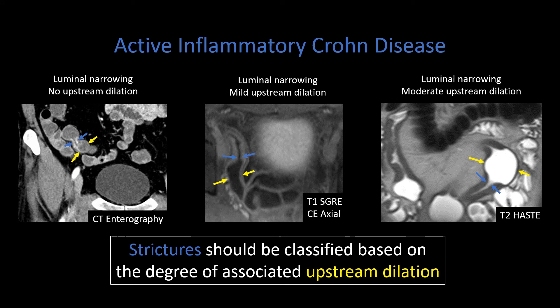Here are examples of active inflammatory Crohn's disease with stricture. On CT, you can see a very short segment stricture characterized by two blue arrows with inner wall hyper-enhancement and luminal narrowing, but without upstream dilation — so we can't definitively call this a stricture, although the patient is certainly at risk. In the next case on a T1 post-contrast image, we can see a longer segment of luminal narrowing with inner wall hyper-enhancement, some degree of mural stratification, and mild upstream dilation — so we can confidently characterize this as a stricture with mild upstream dilation.